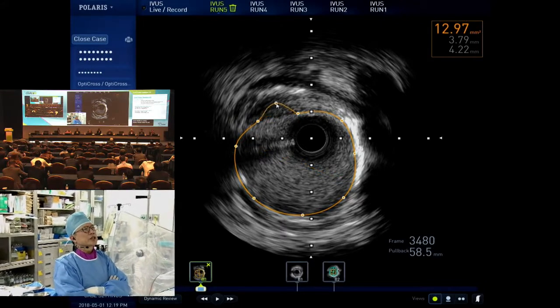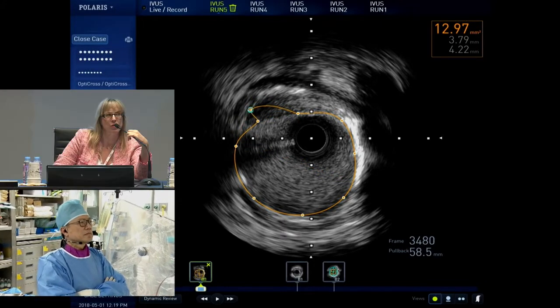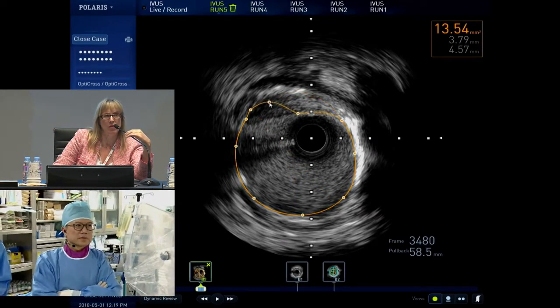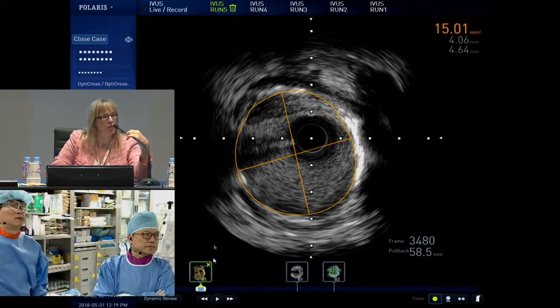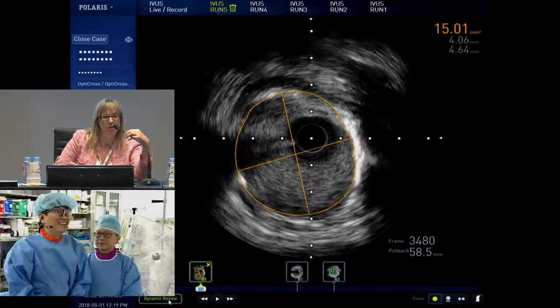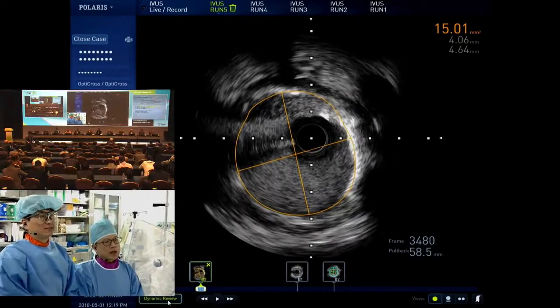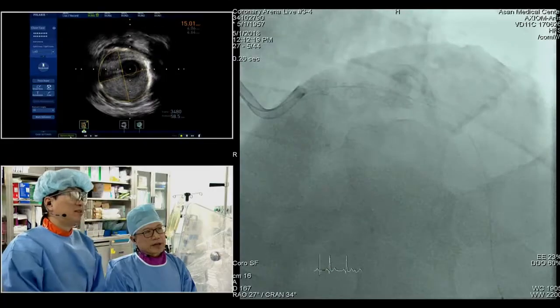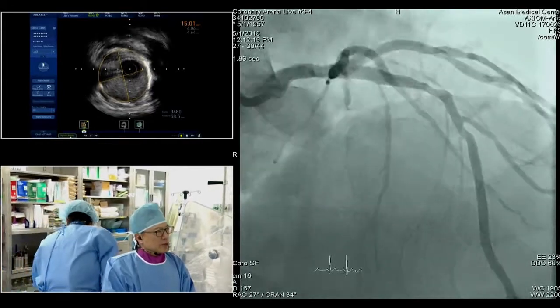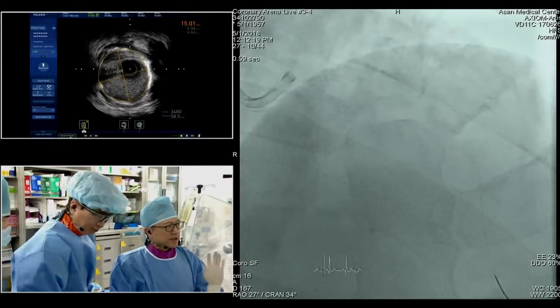Also, a number of studies coming out of Japan show that malapposition in the range of 350 to 400 micron typically resolves over time. So this per se is not a problem, but we should not forget the extent and length of the malapposition. We measured the left main area as 15. So that's the smallest area. Our feeling with the team was that we can leave the LAD alone.